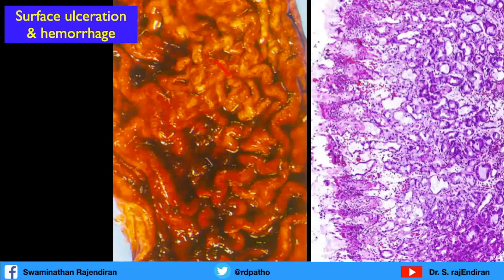Here, this is the autopsy stomach, erosive gastritis. Okay, so it is extensively hemorrhagic. When you take sections from the stomach, you will see a lot of ulceration and hemorrhage. So this is an active process. Okay, extensive ulceration and hemorrhage. As for corrosive poisoning, any other chemicals or any chemotherapy, clinical history is very, very important to make an exact diagnosis.